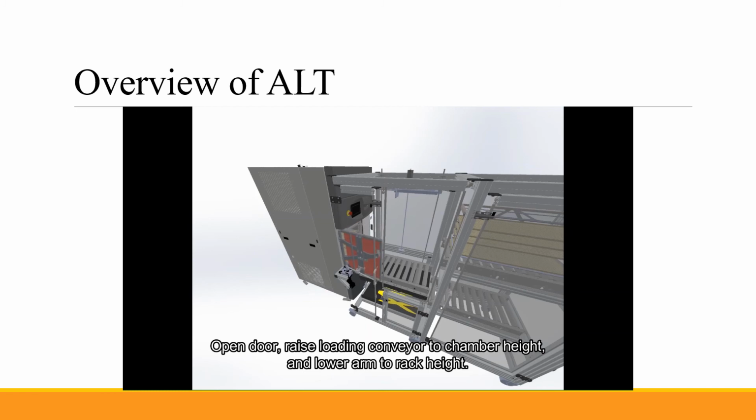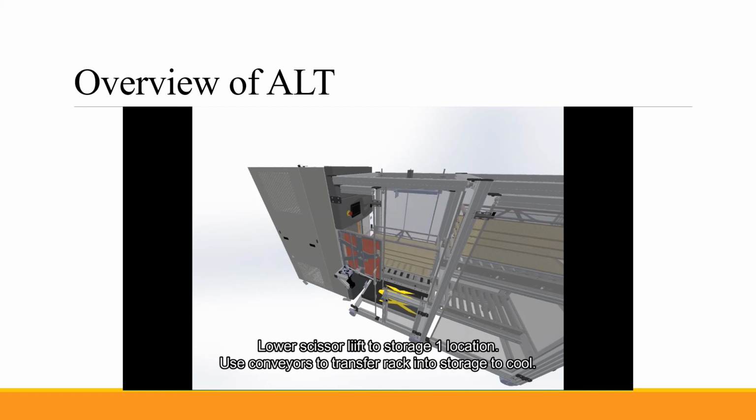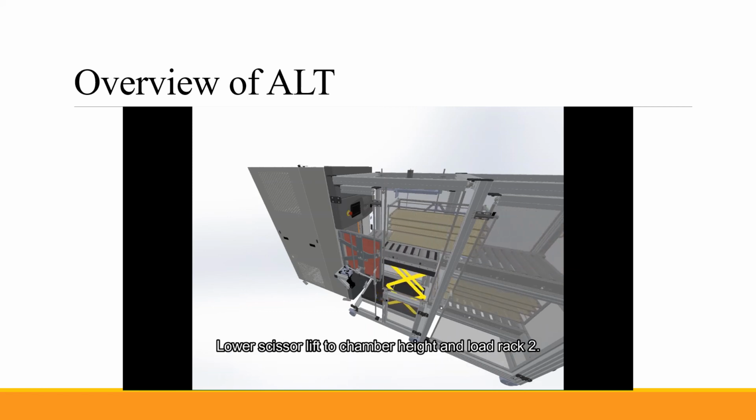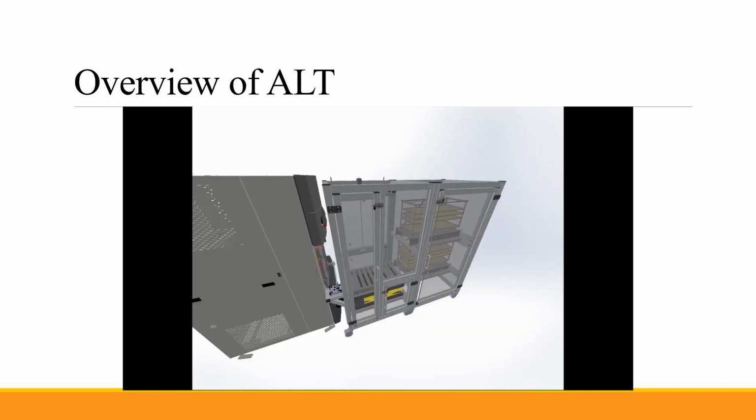After that, the door will open. The rack will be removed from the chamber using an arm. From there, it will be stored back into its storage location. Then the scissor lift will retrieve the other rack from storage location 2. That rack will be loaded into the chamber. And that cycle will repeat continuously until failure.